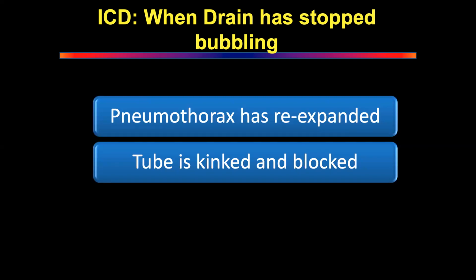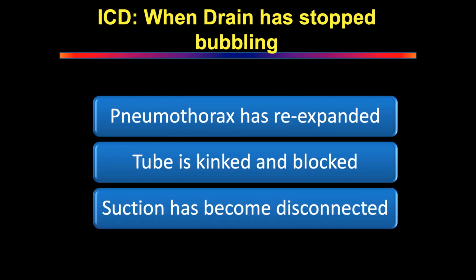Or the tube is connected to the wrong bottle. No underwater seal. No, it was bubbling and then it stopped bubbling. So what is the problem? Suction not working. Somebody just said in the background, suction not working, Nikhil. Suction has become disconnected. Okay?